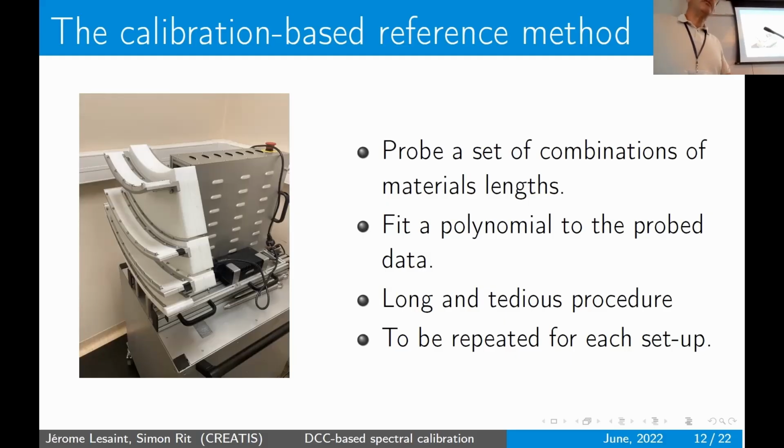Okay, so this is quite long and tedious. It can take up to 45 minutes to calibrate this, and this needs to be done at each operation setup. But this will be our reference method.